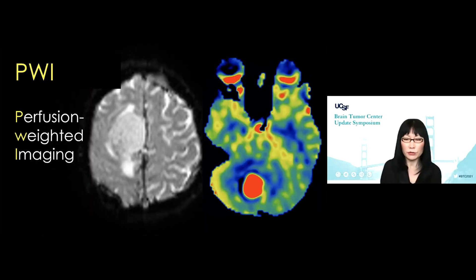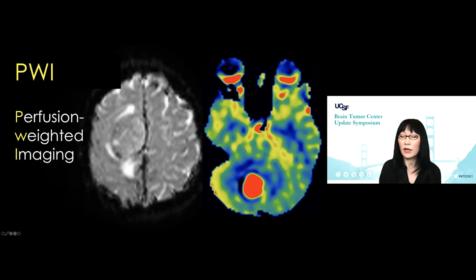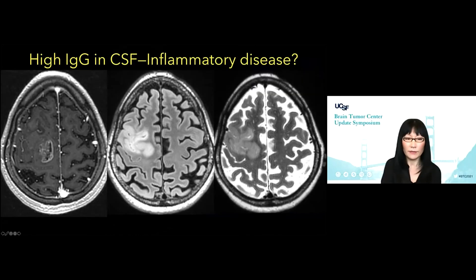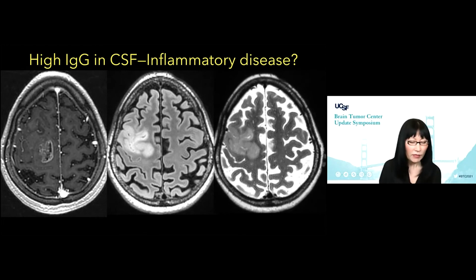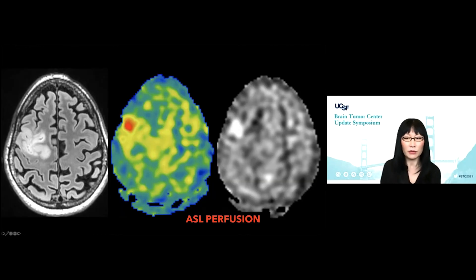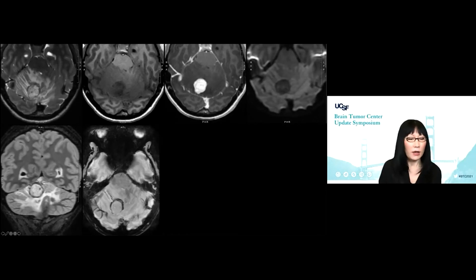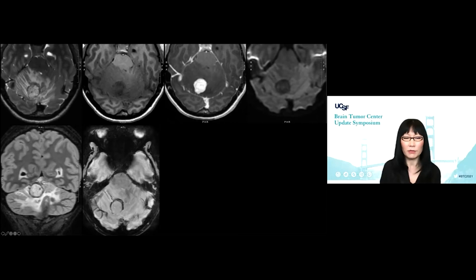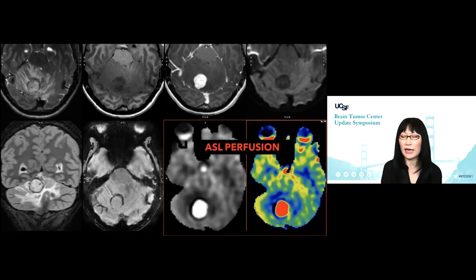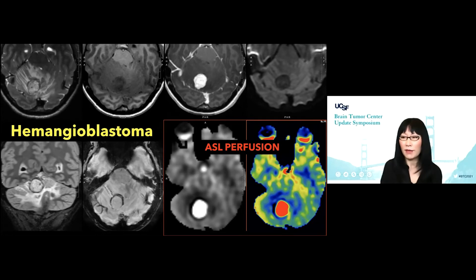Moving on to perfusion — we do two different types: the dynamic contrast enhanced, and also the non-contrast arterial spin labeling. Here's a patient who had inflammatory CSF and was thought to have some type of inflammatory process in the brain. But once you add ASL perfusion, this is a hypervascular solid mass — this is glioma. Here's another patient with a very solid enhancing cerebellar mass. DWI is not reduced, so this is not a cellular mass — clearly not medulloblastoma. But once you add perfusion, we know this is a highly vascular mass, and this is a hemangioblastoma.